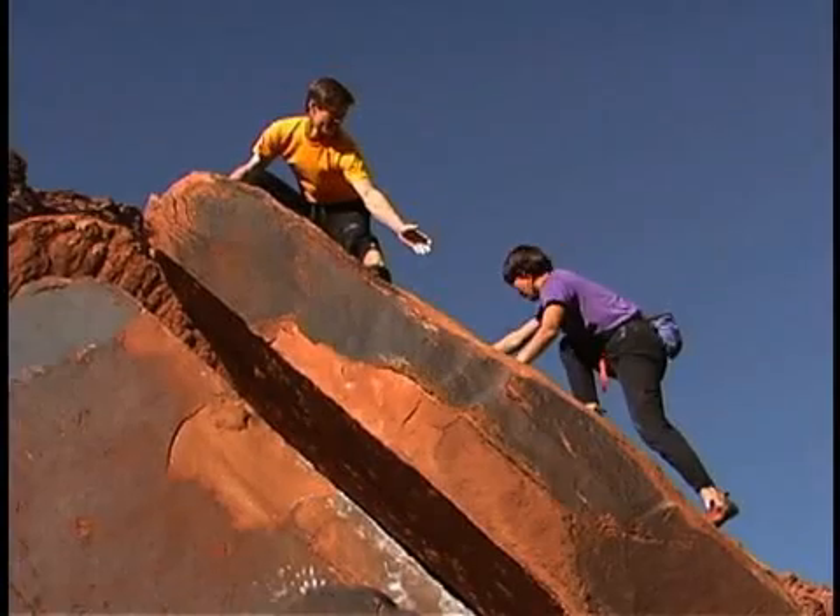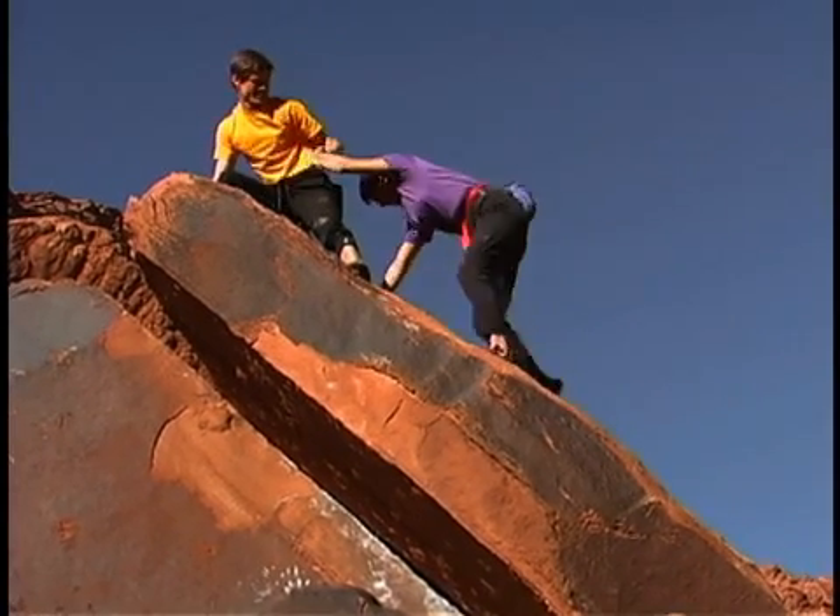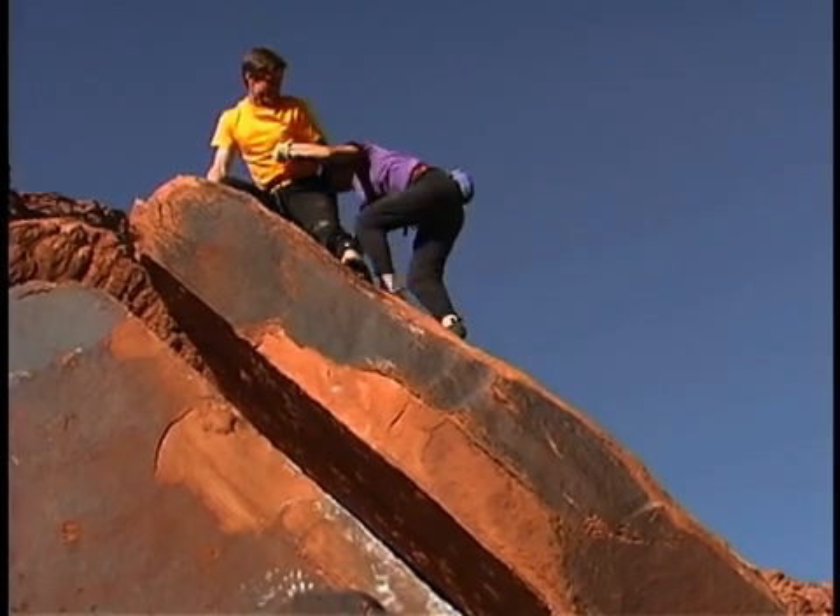You can minimize the discomfort of frequent pricking by alternating fingers, as well as testing from the sides of the fingers where there are fewer nerve endings. No matter what type of glucose monitoring tool you use, know that altitude and changes in humidity can affect the readings.